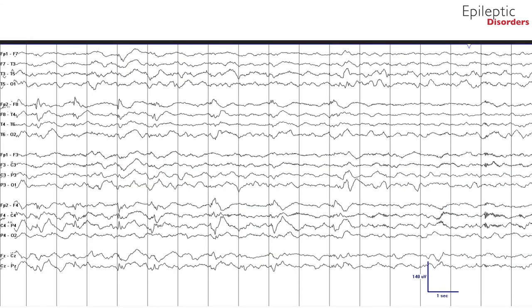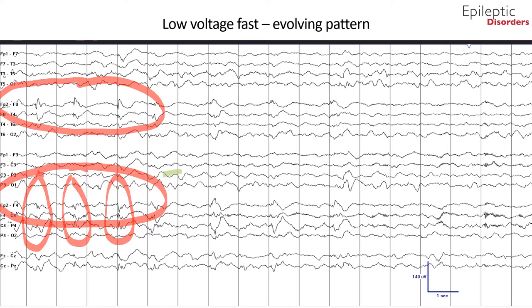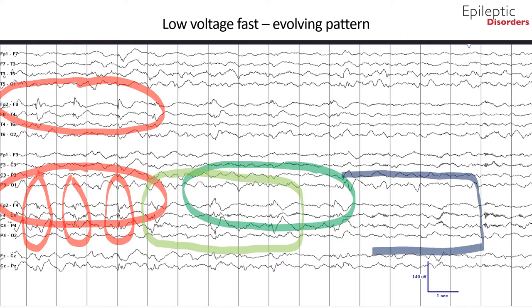In the last page of this seizure shown in bipolar montage, you can see in the beginning well-formed epileptiform discharges over the right frontal region where the previously noted low-voltage fast frequency activity was. Also noted are poorly formed epileptiform discharges in the middle half of the page with a blunted appearance, more representative of slowing.